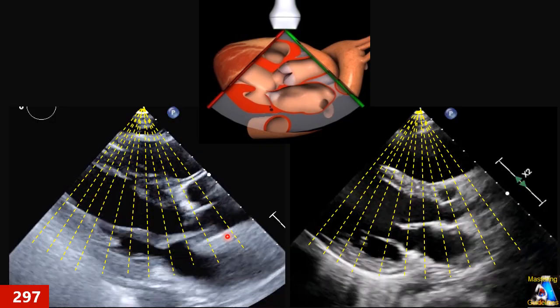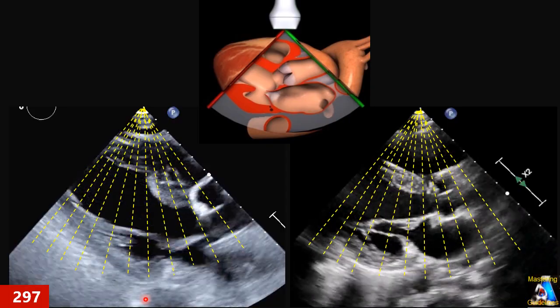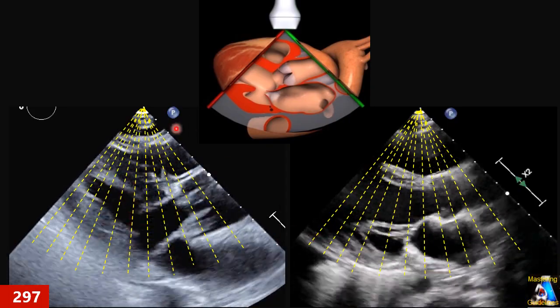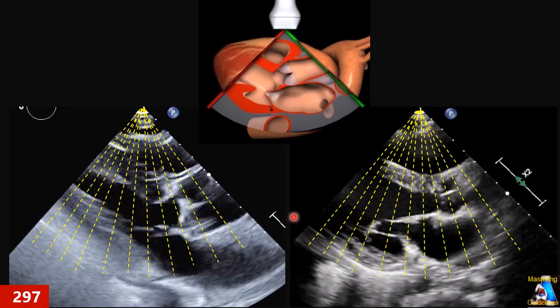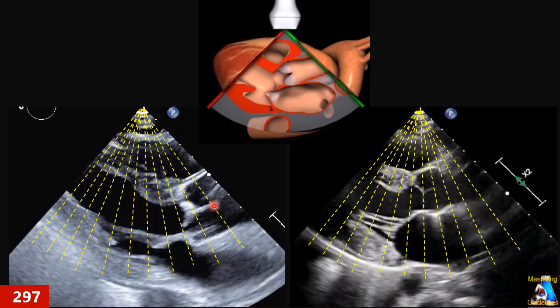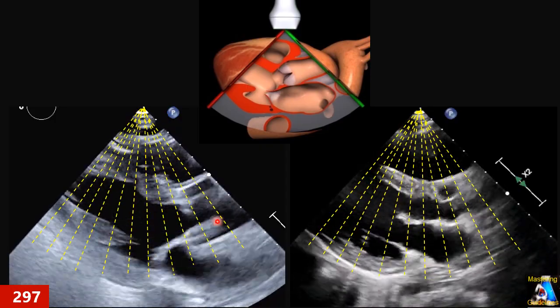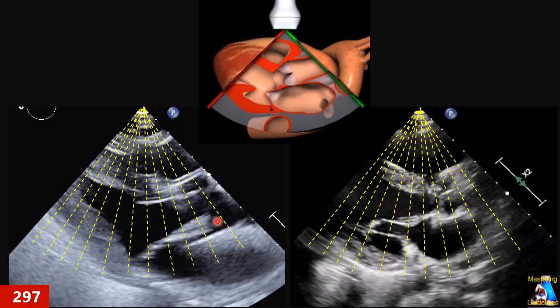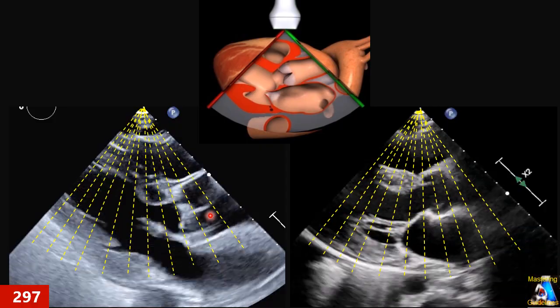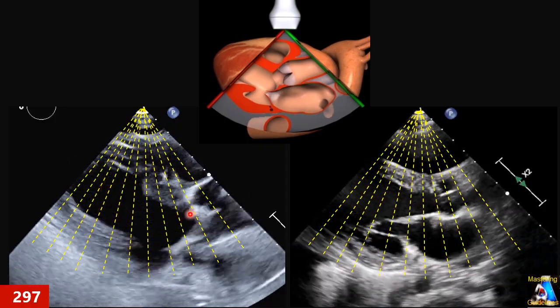Actually, in most centers, besides the PLAX you get one extra image zoomed on just the valve, with good image quality, perpendicular, highest resolution. As long as you know, and the doctor notices why you did that, the cardiologist becomes much happier that you did the extra study and showed, for example, the whole left ventricle.